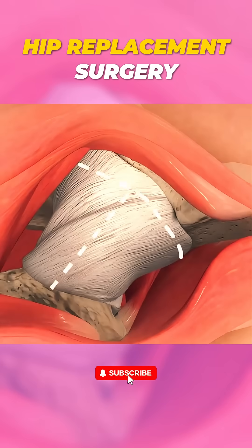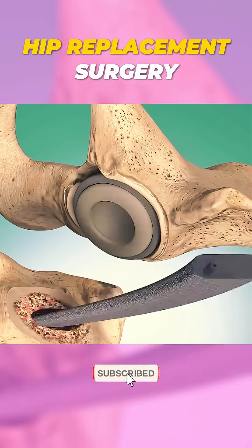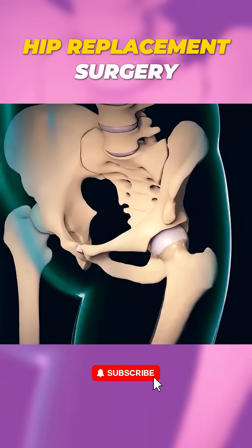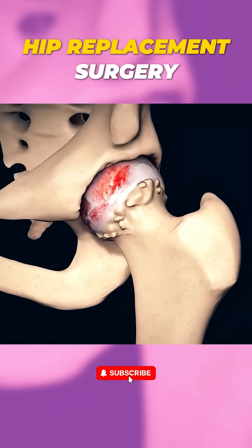Ever wondered how an anterior hip replacement surgery is performed? Let me walk you through it in just 60 seconds. First, let's understand what's going on. The hip joint is a ball and socket joint, and when it wears out, it can cause pain.